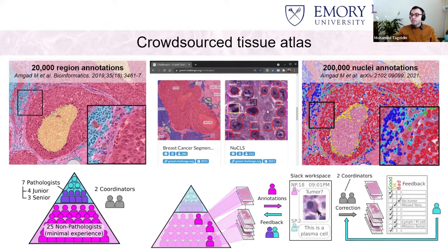That's a laborious process. And we can't really be asking pathologists to do something like that, this extremely repetitive task, and expect that this will be repeatable. We may do it once, we may do it twice, but it won't be a robust process that we can repeat over and over again for different projects. So something has to give, and we thought maybe we make use of crowdsourcing.